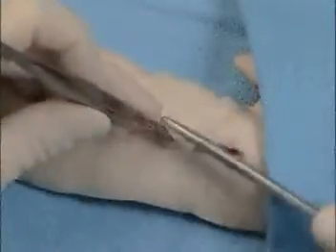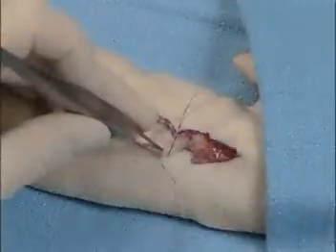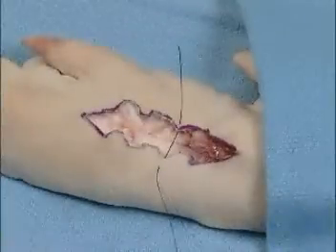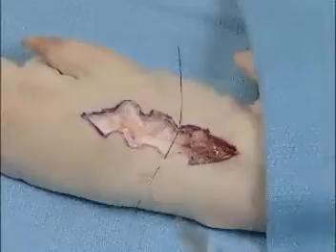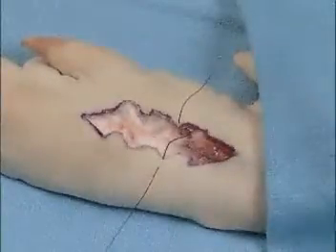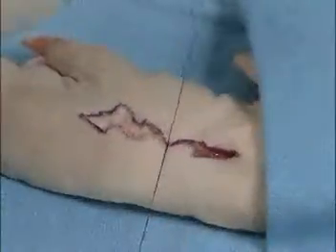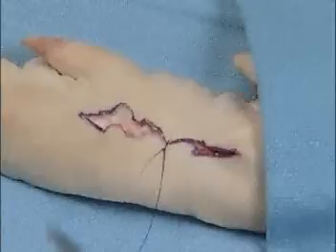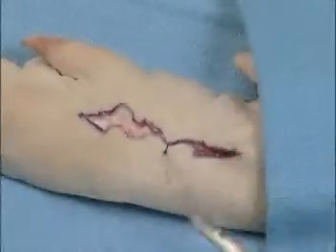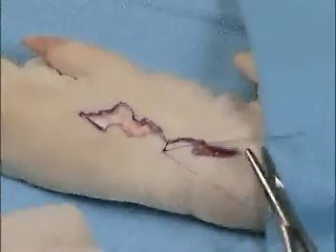There he's trying to close the tissues, and you can see we're now placing the sutures from apex, from peak to valley, and the tissues being well undermined allows the closure to occur with minimal tension. You want to close it with minimal tension to prevent widening of the scar postoperatively. And of course, you want the edges to be everted. So a technique is utilized to make sure that these edges are everted.